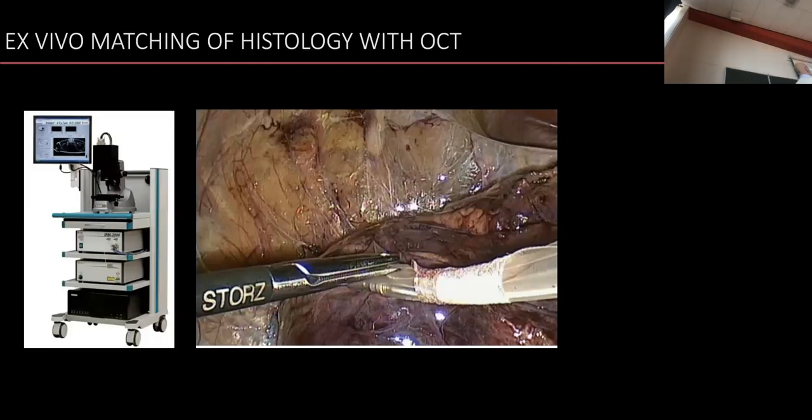Again, this was back in the days. This was an approach developed as an interface with an OCT system that we had on the shelf. We connected both, and during laparoscopic surgery, the surgeon would take our tiny OCT probe, although this one was bigger than the one that we use in cardiology, about double the size. Take it with one of the laparoscopic tools, the grasper, and maneuver it towards the kidney tumor. That's something you see here. You can see the kidney, and you don't really see that there is a tumor underneath. Place it on the tumor, and we can start to do imaging.